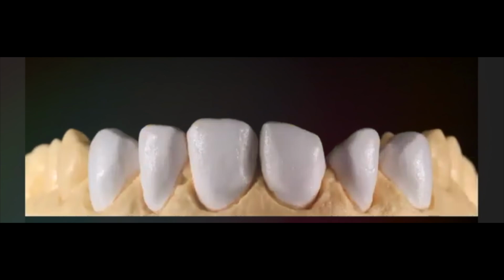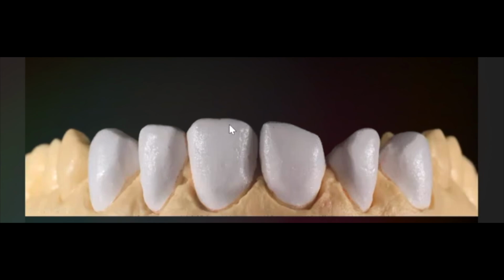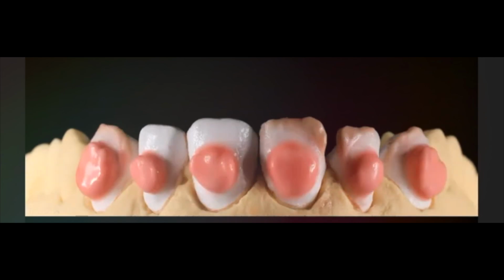We bake this material, and then we start with opacious body to correct the sizes, the opacity. So when we are missing volume, like here, we use the opacious body to apply the same volume like the symmetric central and laterals. So we try to do the same situation. We are trying to apply symmetry.